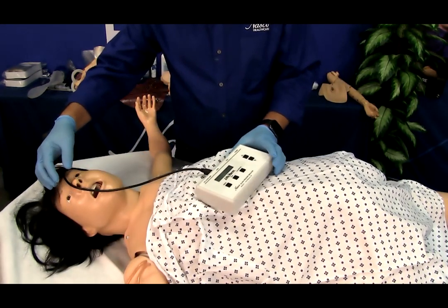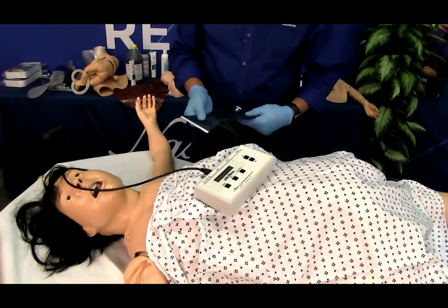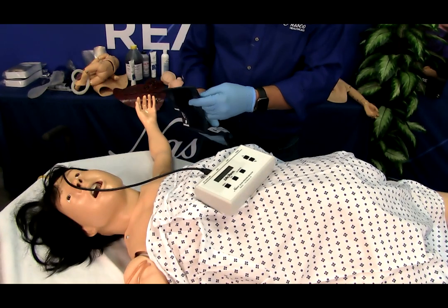Attach this end of the pressure line to the female luer fitting assembled at the top of the electronic control unit marked cuff.